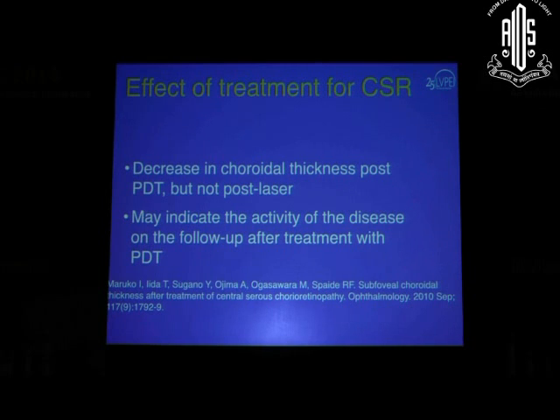So you might have to consider that's one of the reasons why we started doing a low fluence PDT for these patients, so that the effect of that is a little less. So that's how the OCTs help you in central serous retinopathy.